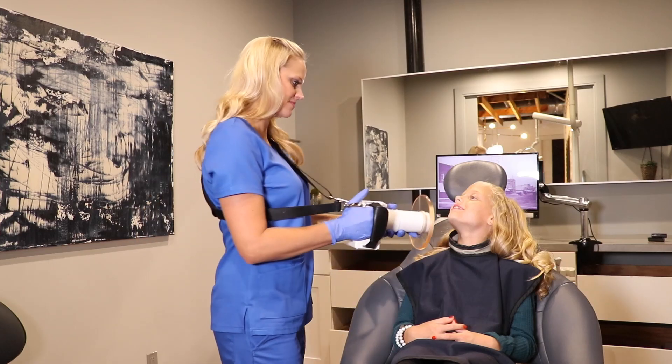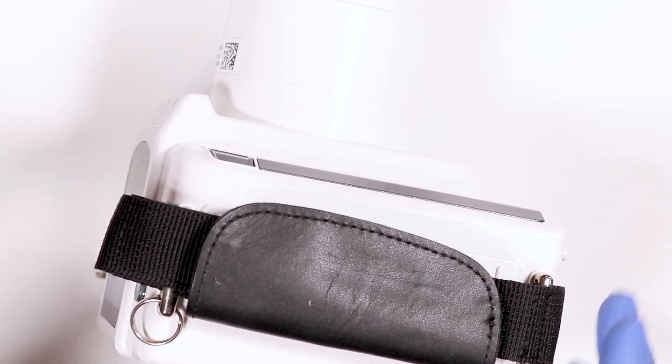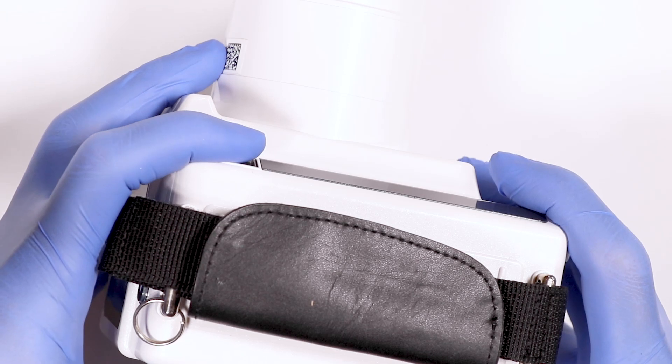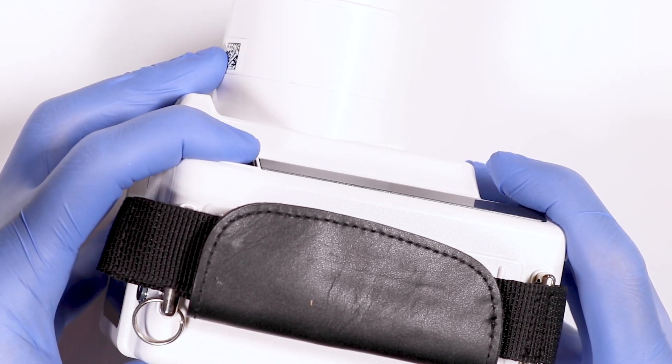For pedo anterior images, you can position the patient in the chair facing forward. If you are left-handed, you can turn the unit sideways and expose using your left hand.